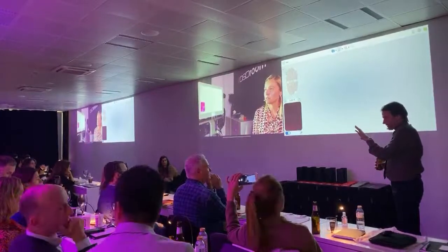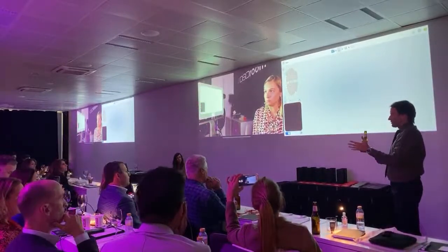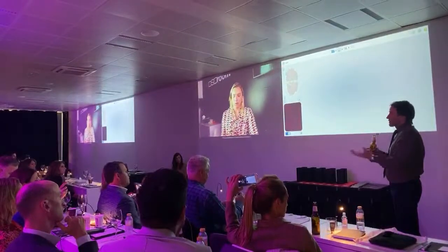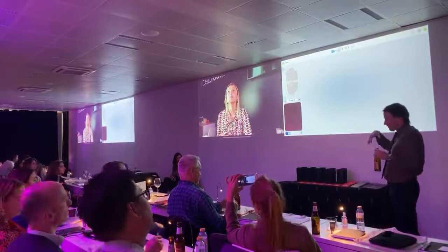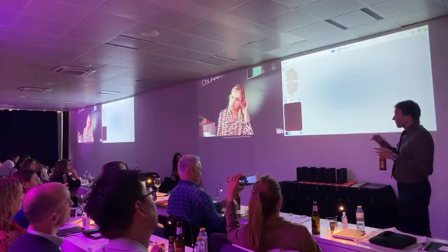Point number 1, you scan the palate. Why? The magic of overlapping. We need information. Of course, if it's an easy buccal veneer case, you have all the remaining tooth structure to overlap. But if you're prepping crowns, you want the palate to be able to overlap the files, okay?